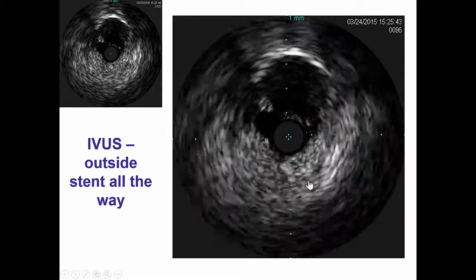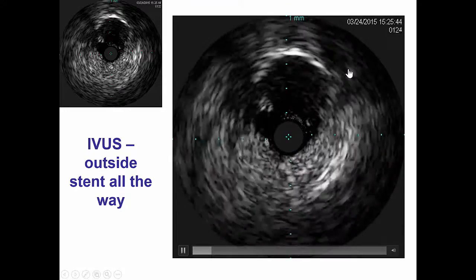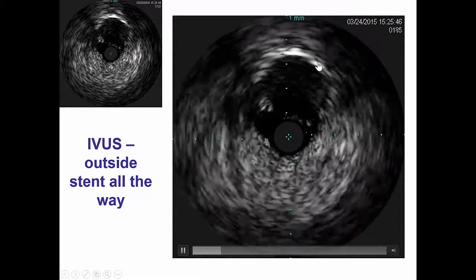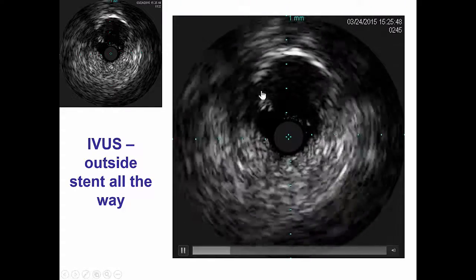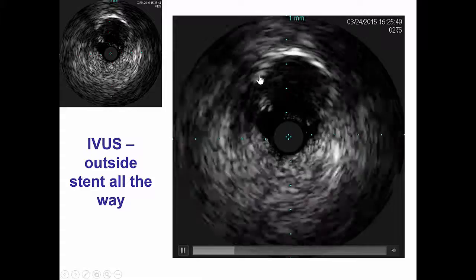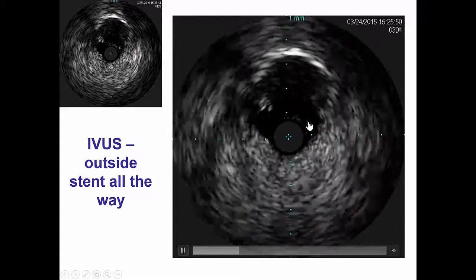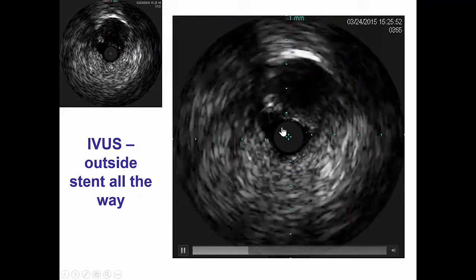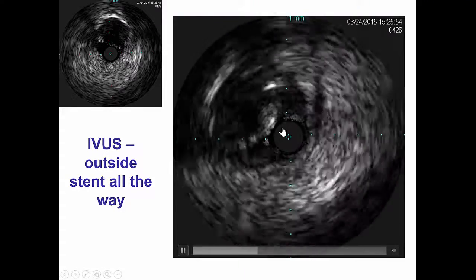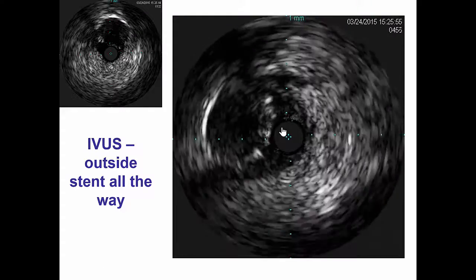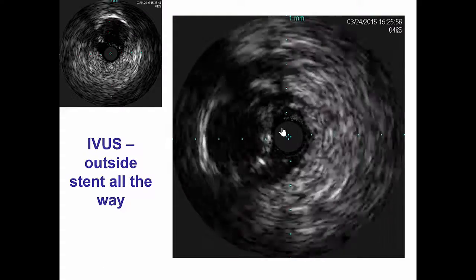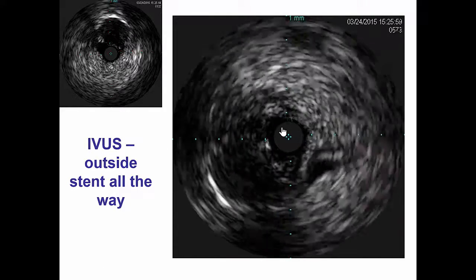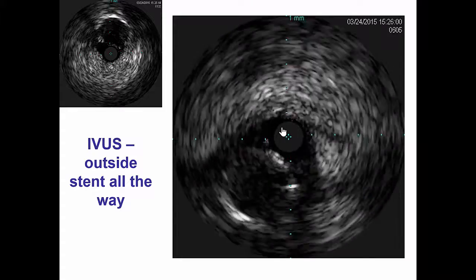We did intravascular ultrasound, which shows what we knew already from the angiogram — that we had crossed outside the previously placed stent. We had essentially a subintimal crossing path all the way from the posterior descending artery all the way up to the proximal right coronary artery.